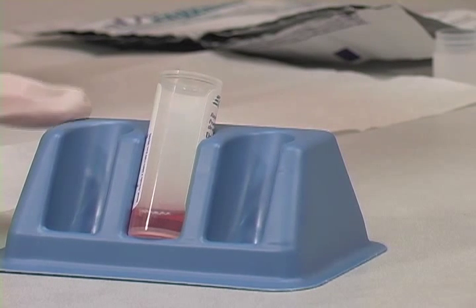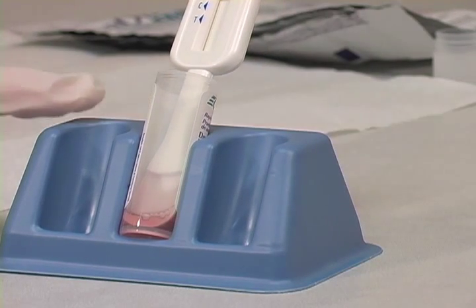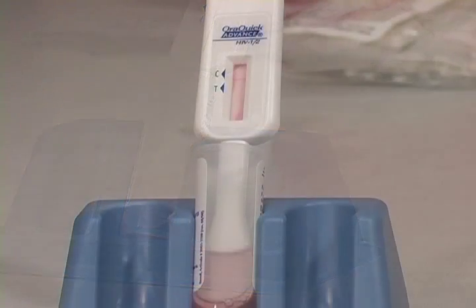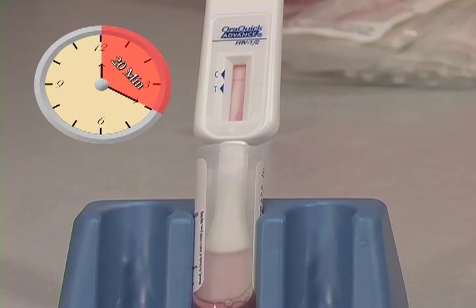Insert the flat pad of the device all the way into the developer solution vial. Start timing the test. Do not remove the device from the vial while the test is running. Pink fluid will appear and travel up the result window. The pink fluid will gradually disappear as the test develops. Read the results after 20 minutes, but not more than 40 minutes, in a fully lighted area.